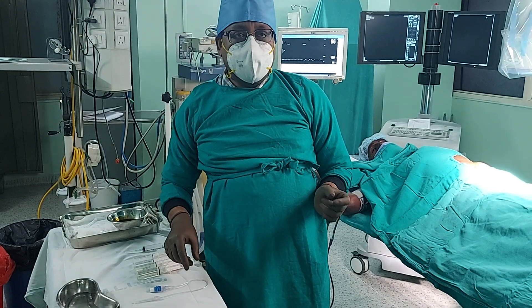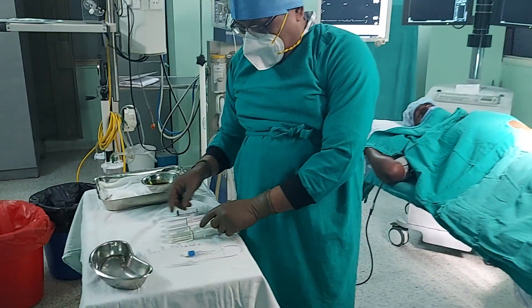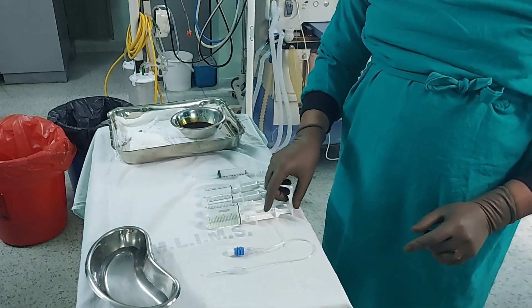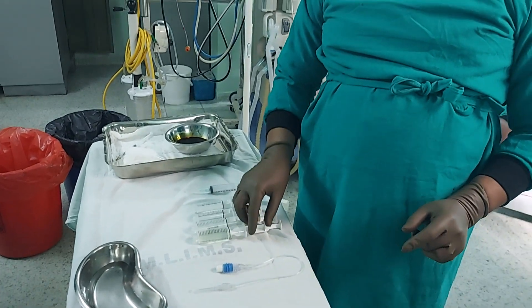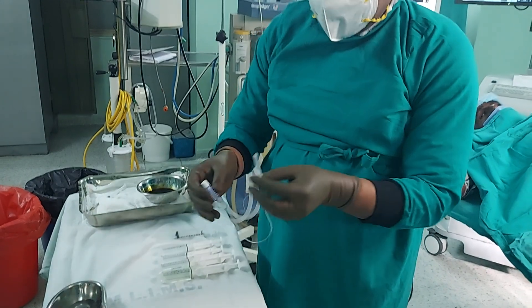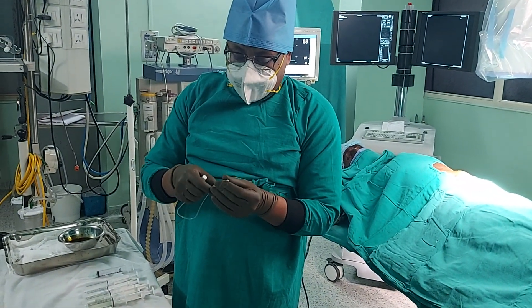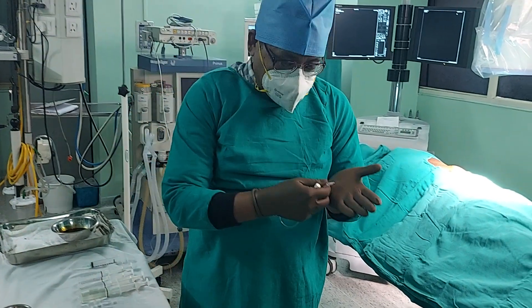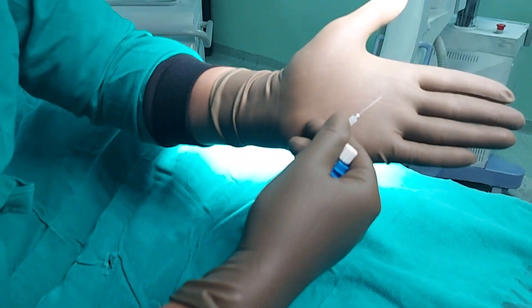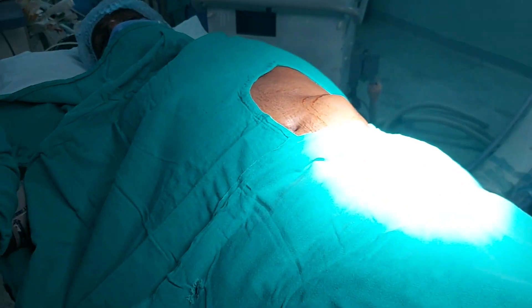Currently our patient is on 0.6 milligram of morphine, and here you can see the tray where we have collected the drug which contains morphine as well as normal saline. This is a specialized needle which we are going to use to puncture the diaphragm, and here you can see the bevel is a specialized bevel so it does not harm the diaphragm of the intrathecal pump.